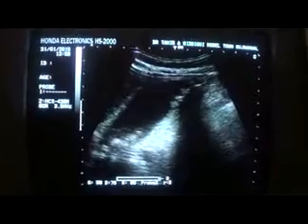Now see the scanning plan. The scanning plan is with the patient in left lateral decubitus posture. This is the subcostal line. I have placed the probe. Now I am not performing the ultrasound in line with the subcostal region. Initially I was doing the scan placing the probe vertically below the costal margin, mid-costal margin, and then angling the probe towards the patient's left shoulder and then angling this way.